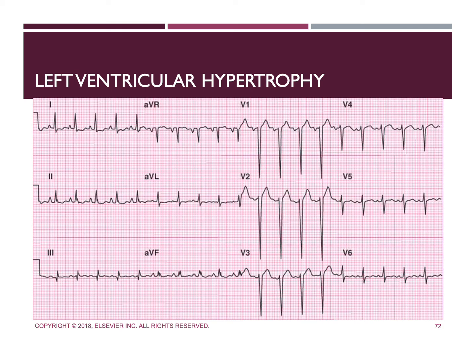All right, now we're looking at an ECG strip of LVH, left ventricular hypertrophy. What I want you to note in this is that the ST segment is going to be elevated in leads V1, V2, and V3. Although several formulas exist to assist in recognizing LVH, the Cornell voltage criterion is often used to check for the presence of LVH.